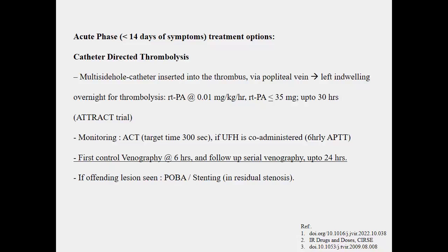the substantial recanalization of the thrombosed vein. In that process, if we could see any offending stenosis in the proximal vein, we do a balloon dilatation and we keep it dilated.